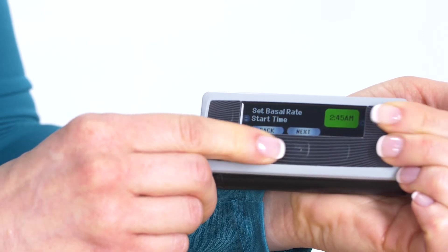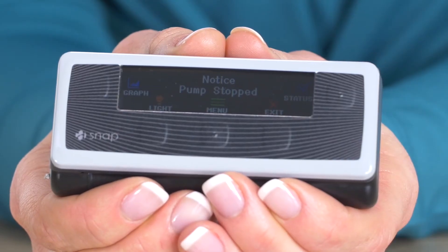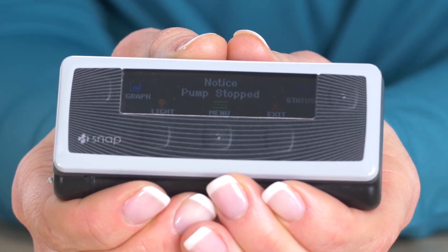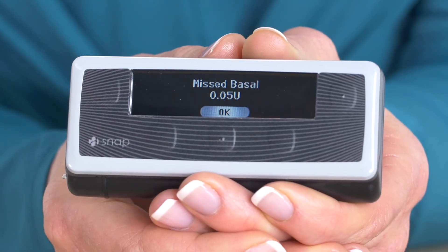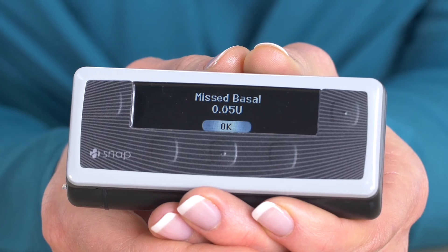When changing your basal rates on SNAP, it's simple. If you're wearing an insulin pump, there will be times during the day that you will need to disconnect, such as for taking a shower or exercise. You can put your pump into stop mode. Once I want to start my pump, I will get a message that tells me how much insulin I've missed. I can then make a decision if I want to take this insulin as a bolus for better blood sugar control. This feature is unique to SNAP and no other pump offers this option.